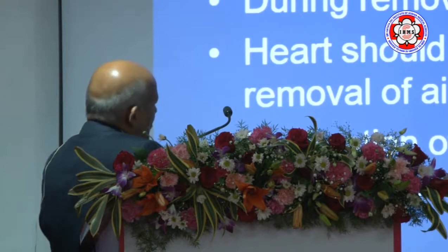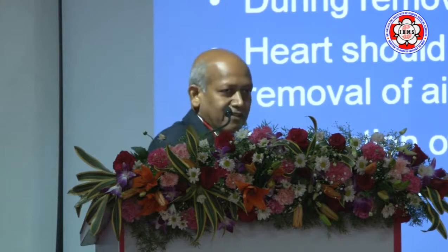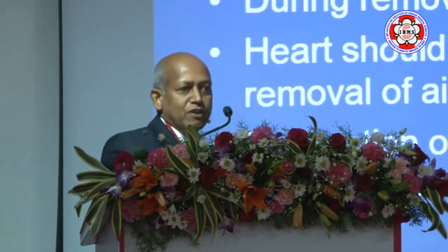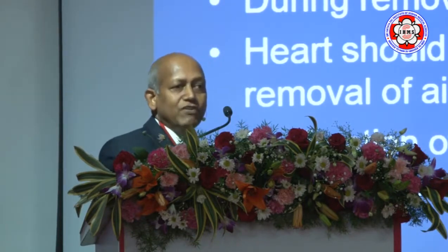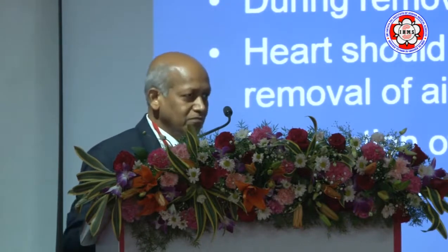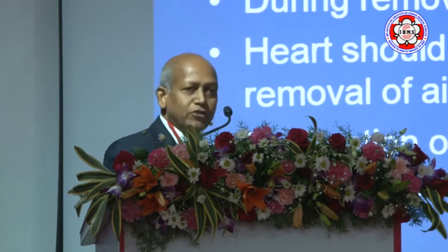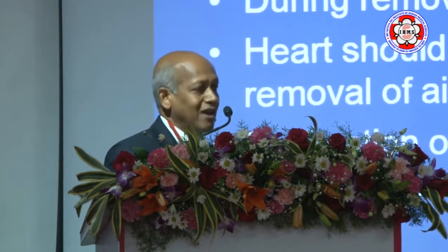One of the things is the heart should not be tipped after putting the valve. Because once you put the mechanical valve, you lift the heart, that's a fixed point, and you're going to have an AV groove separation. And in my practice for the last 20 years, the way I de-air the heart, not through the apex, but transeptally. I go right through the RV, across the septum, into the LV. That's the most non-dependent part of the heart.